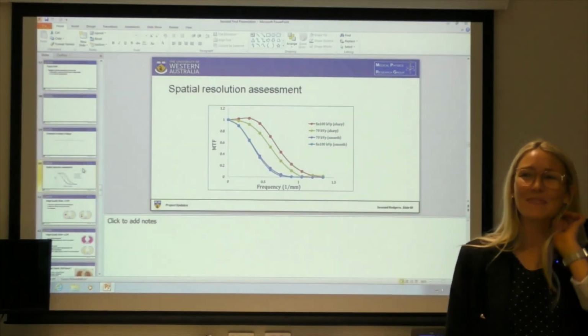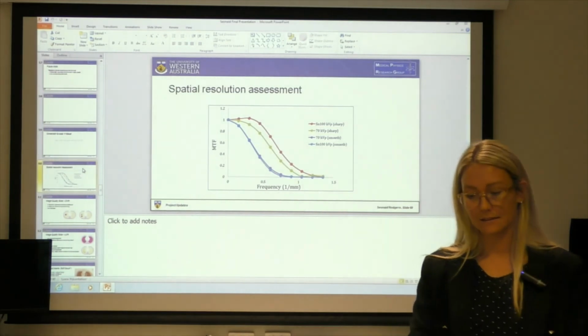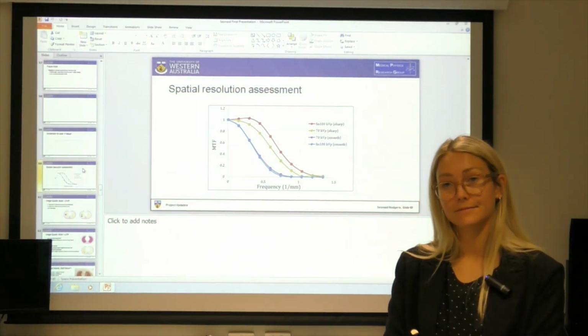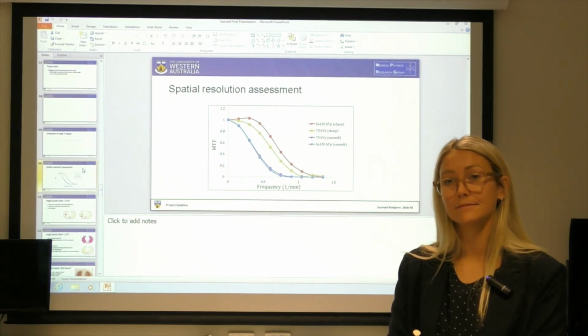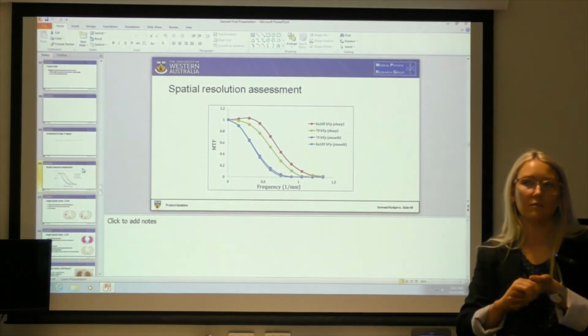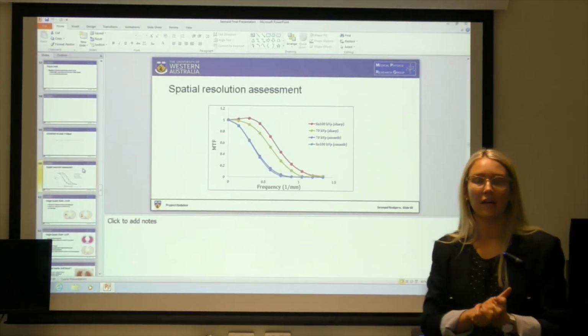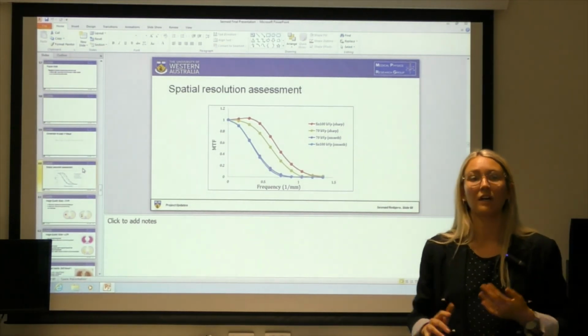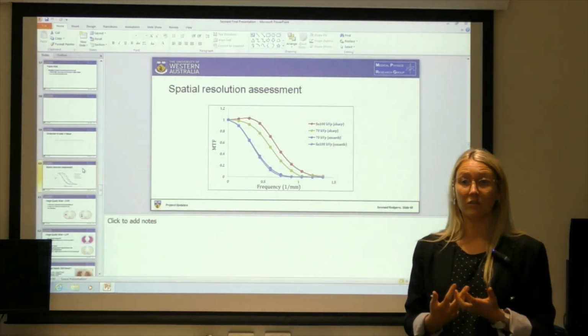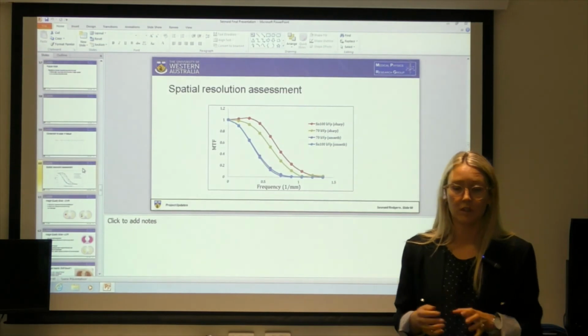So, clinical chest scans. Is there enough of a qualitative difference, do you think, between the 70 and the 100 filtered to ever recommend 70? I think that it depends on the diagnosis. You'd never use the tin filter if it was an oncology patient and you're looking for soft tissue nodules.